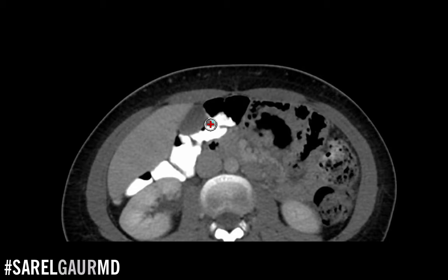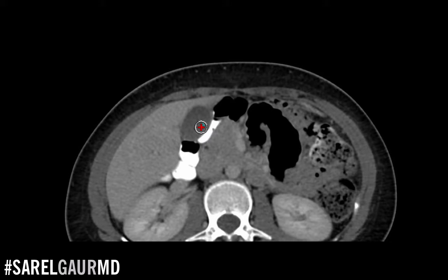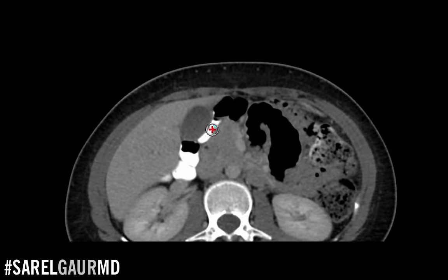The other thing about ultrasound is it's very good for resolving fluid-filled structures. A normal gallbladder internally is going to be full of bile, so we get a very good visualization of fluid on ultrasound, meaning the gallbladder is really well-visualized.